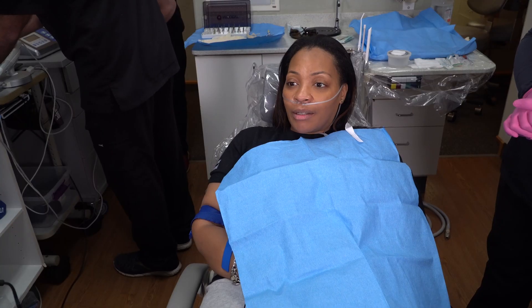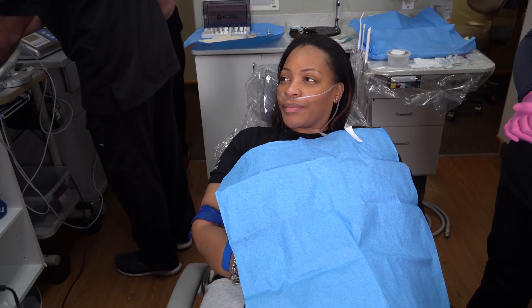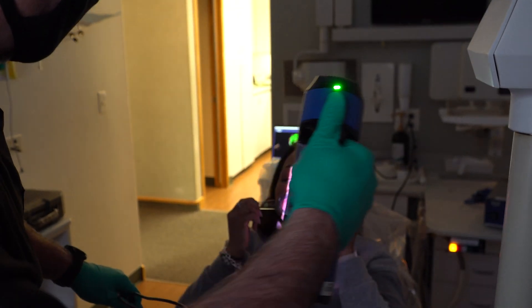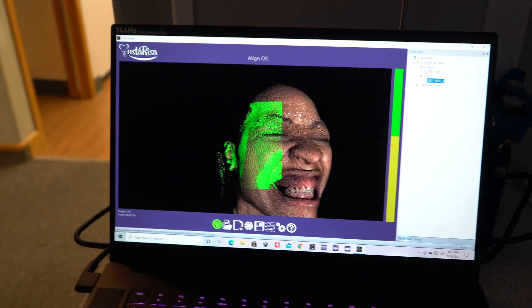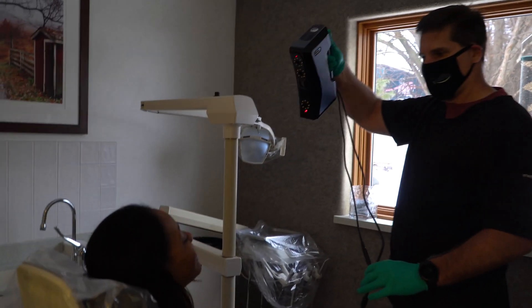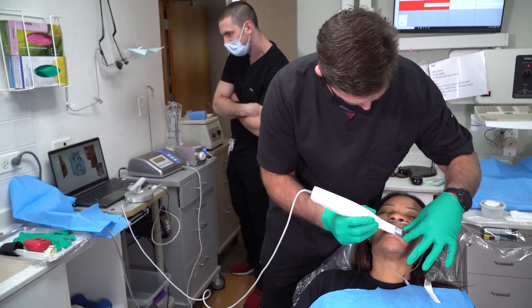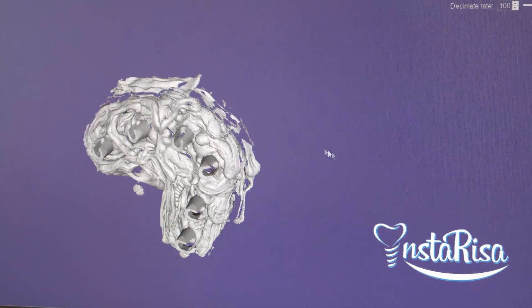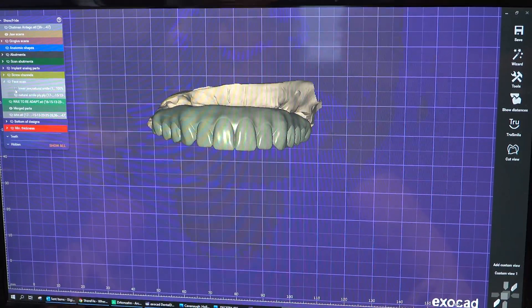I'm nervous but excited about the results, just wanting to take a new leap on life. Utilizing our InstaRisa 3.0 facial scanner, all of the pre-op planning was done beforehand. We were able to digitize her face three-dimensionally in different lip positions. We used a TRIO scanner, digitized her teeth, and merged those files together to diagnose and design her teeth in exactly the right plane and exactly the right position for her face.